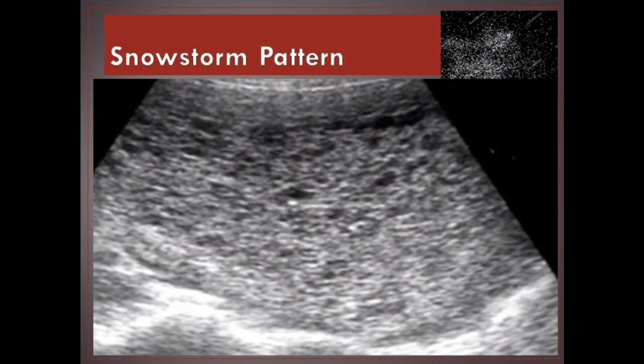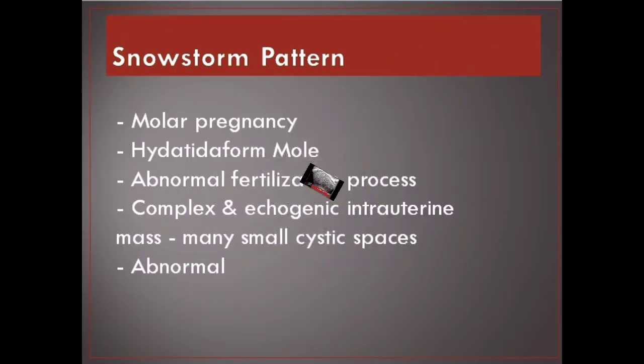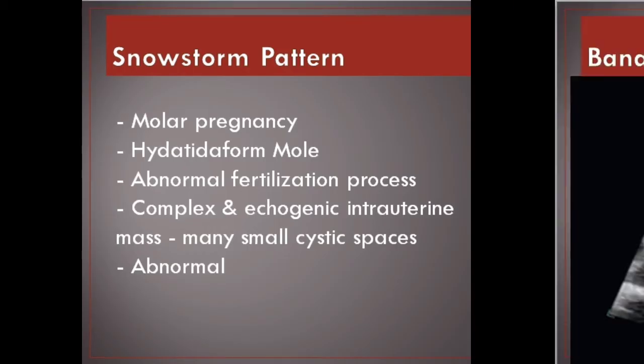Snowstorm pattern. Molar pregnancy — abnormal fertilization process presenting as a complex and echogenic intrauterine mass with many small cystic spaces. Abnormal.